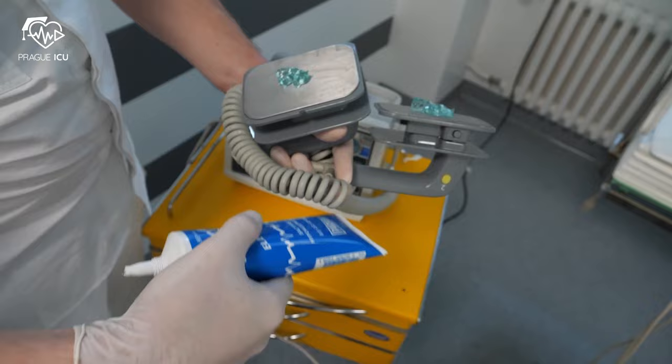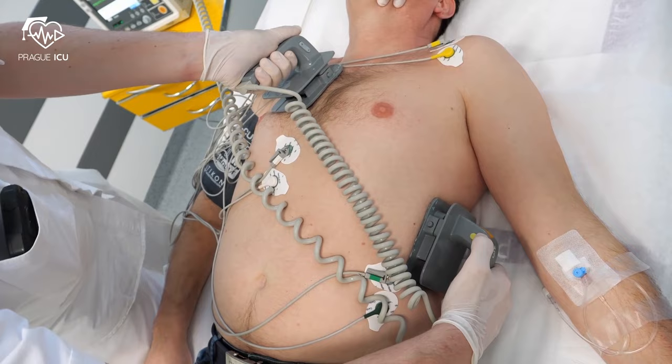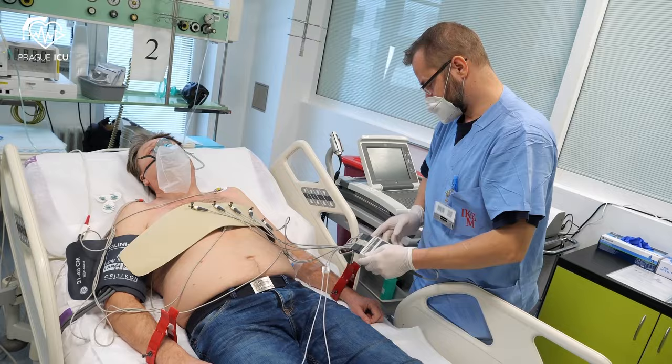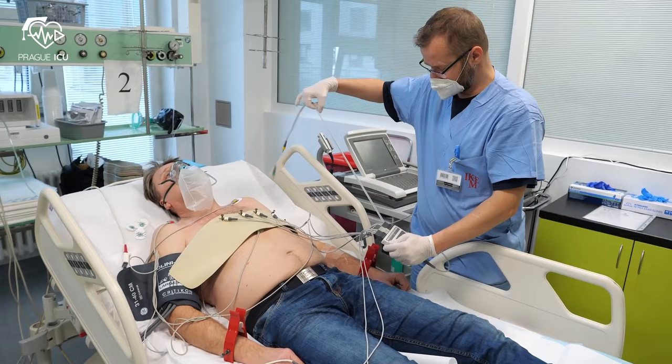Then proceed with shock application, with a maximum of 3 shocks. Check ECG, vital functions, and neurological status immediately and regularly during the one hour following the shock.